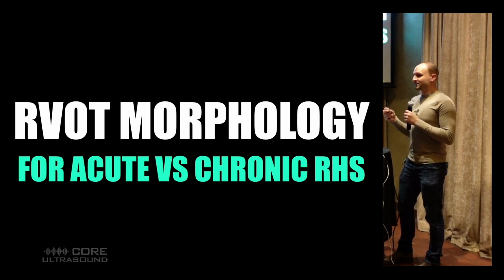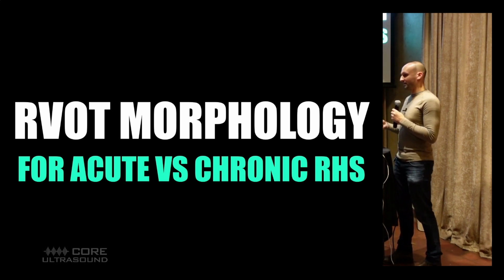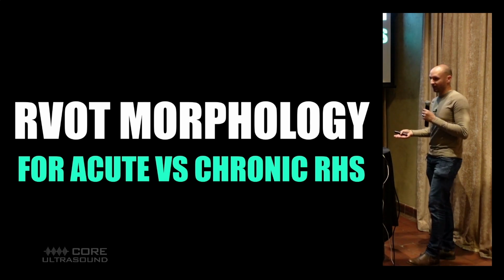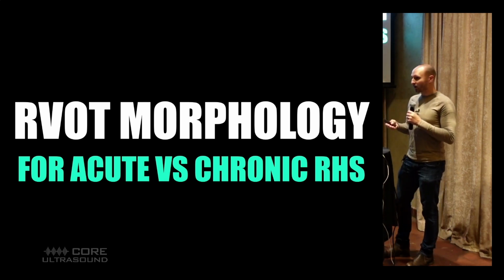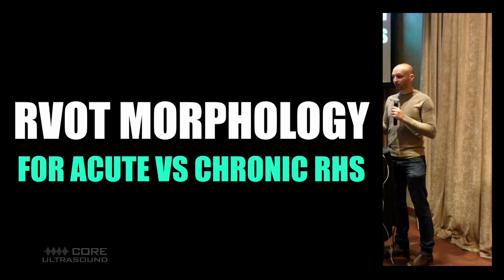So the problem is you have an elderly patient that's been smoking their whole life, they work in coal mines, they have chronic RV enlargement, they come in acutely short of breath. Is that right heart enlargement acute, or is it chronic? Is it just right heart enlargement, but they also have a cold or something like that? Or do they have COPD and they also now have a pulmonary embolism? There's a lot of different tricks that you can do.